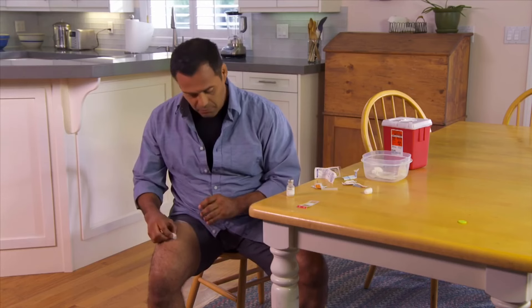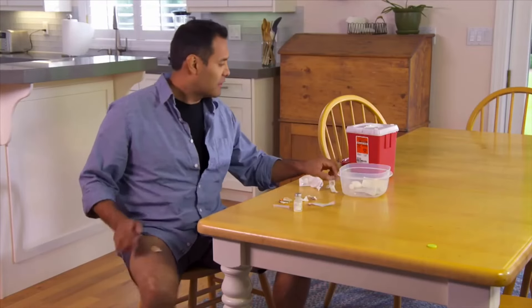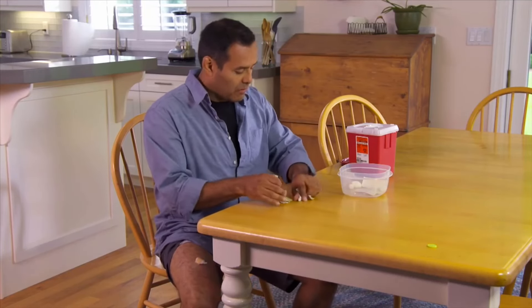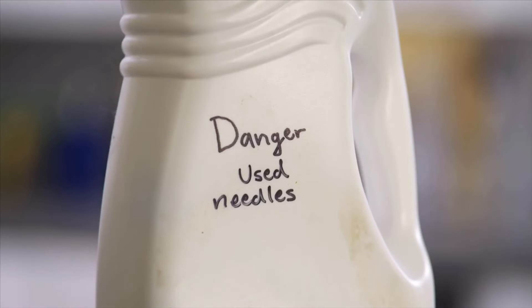You may need a cotton ball and an adhesive bandage for bleeding. Don't try to recap the needle — you could stick yourself. Put the used syringe into a sharps container. It's easy for needles to go in and hard for them to come out. If you don't have a ready-made sharps container, you can make one using a jar or bottle made of stiff plastic with a screw-on cap. One example is a detergent bottle. Label it very clearly as dangerous. Anyone who sees it will know to leave it alone. You should keep the container in a safe place, out of reach of children and pets.